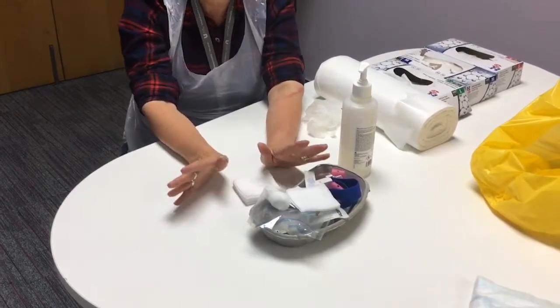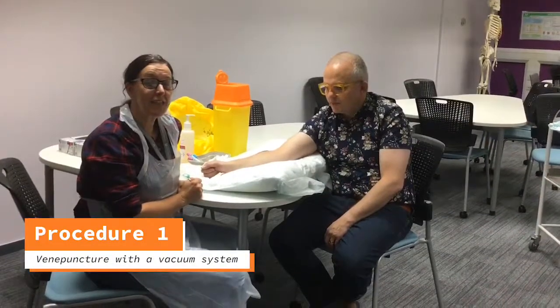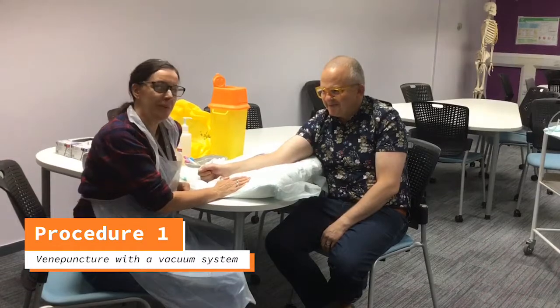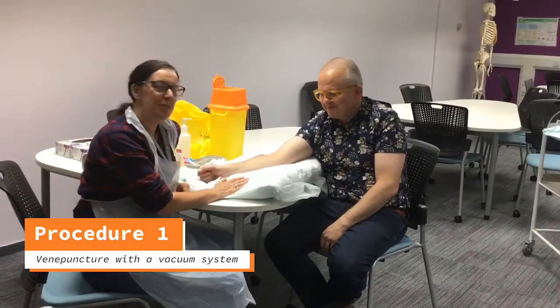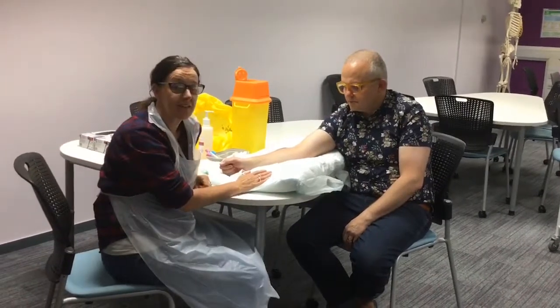The most important thing you need now is your patient. My lovely patient here, Mark Wheatley, has kindly volunteered to let me take some blood from him using the vacutainer and the butterfly.